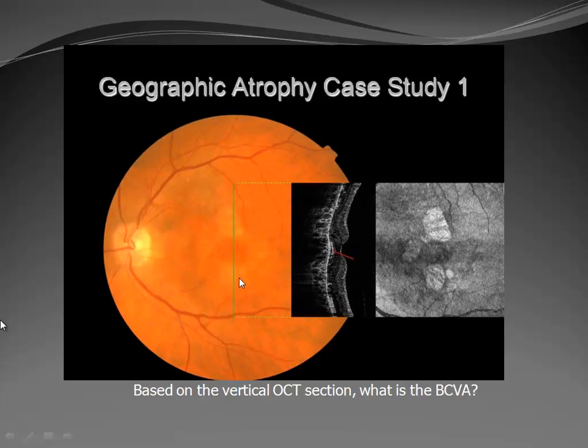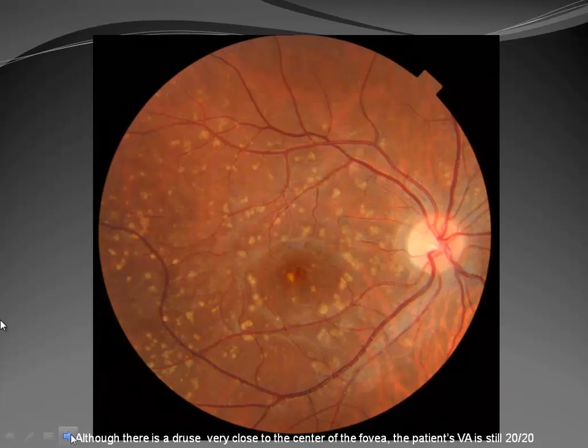I didn't test this patient on the Maia yet, the microperimetry test. That will be interesting if I can get this patient back for that. But this is geographic atrophy. Geographic atrophy is dry mac degen, but associated with 20% of substantial vision loss in patients with mac degen. 80% of patients that have less than 20/200 acuity have wet mac degen, but 20% actually have geographic atrophy.